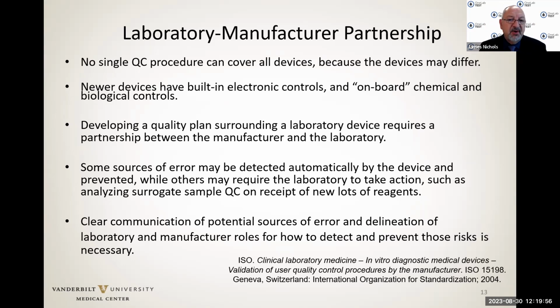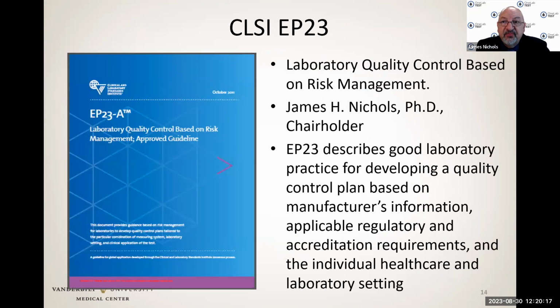So clear communication of potential sources of error and delineation of the roles of the laboratory and the manufacturer are essential components of risk management. Understanding what the manufacturer can detect and prevent and what we have to do in addition to that as laboratorians.